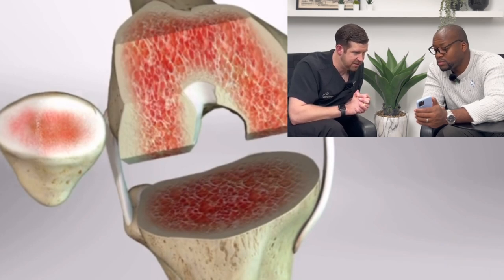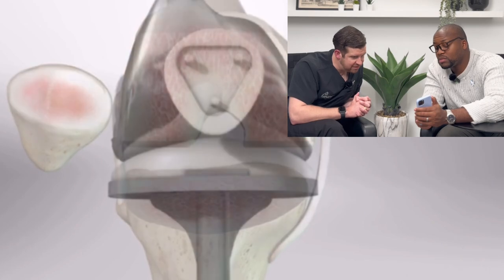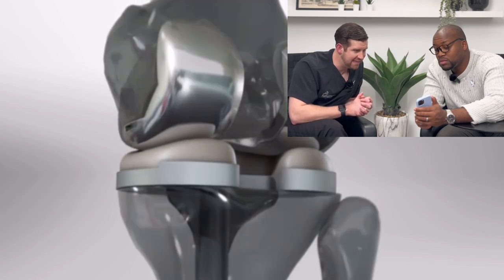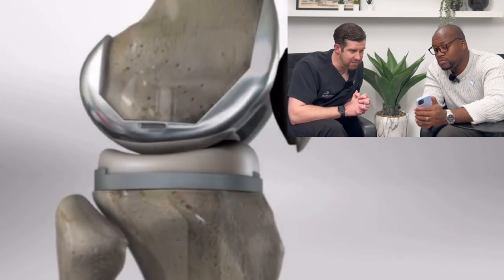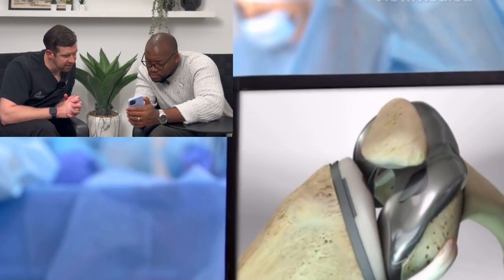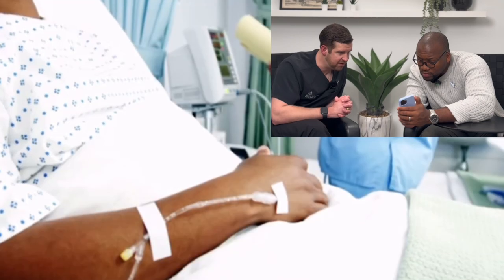You can see that the ligaments are still there; they're still in place, and we depend on those for the knee to function properly. The pieces, once put in, come in many different brands but are all pretty similar in design. You have to anchor the implant inside the bone — either with a small peg, a bigger peg, or cement. Sometimes you can make it so the bone grows into it, but they have to stick to the bone. That's how it glides smoothly, and we try to keep the basic mechanics of the knee once we replace it.